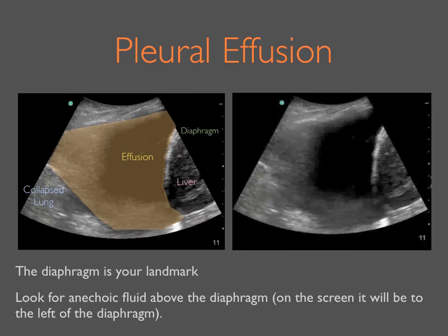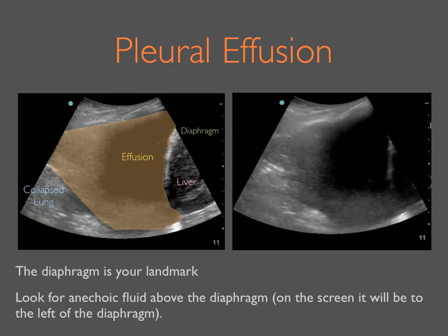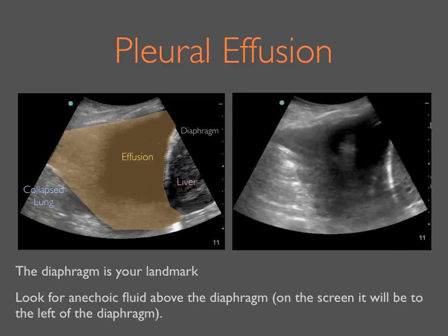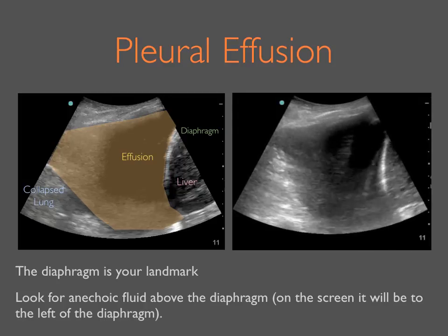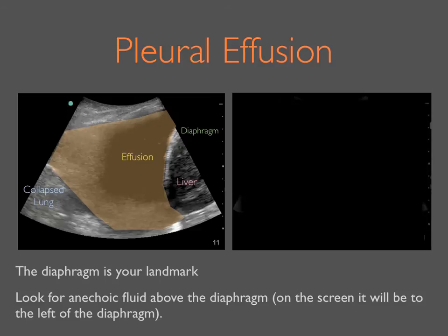If an effusion is present, you will see anechoic fluid surrounding the base of the partially or collapsed lung and outlining the bright white diaphragm. Here we see the curved hyperechoic diaphragm with a large thoracic effusion and collapsed lung visible on the left side of the image.